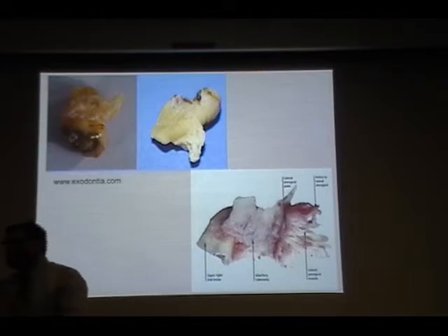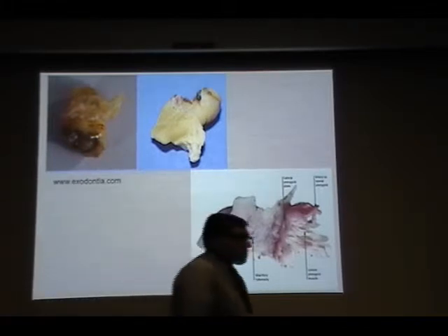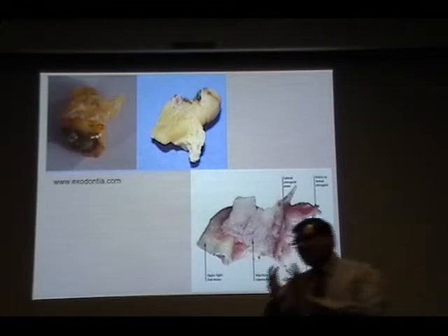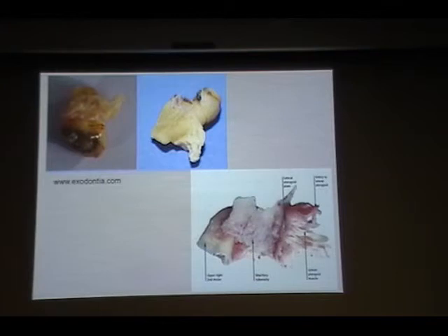But my favorite instrument for most of the extractions has been the periosteal elevator, based on my own personal experience. If you know how to manipulate, because most of the teeth are sitting straight in the sockets, the periosteal elevator has a nice scoop, a spoon-shaped end.